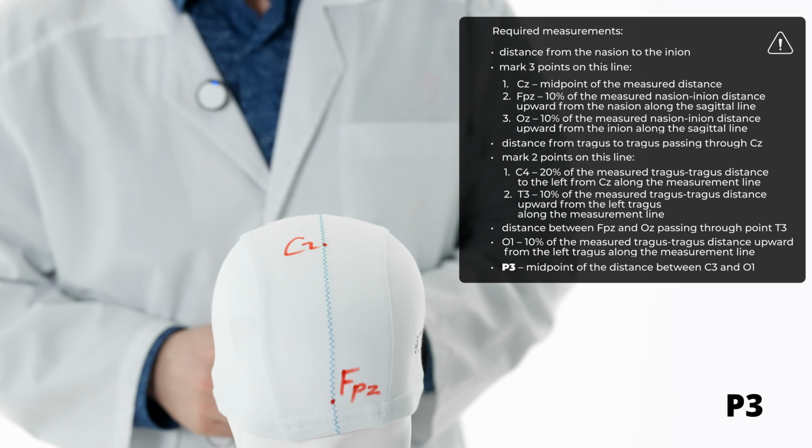Next point along this line is T3 point that lies 10% up from the left tragus. So in our case, this distance equals 3.4 centimeters, and mark T3 point. After that, measure the distance between the OZ and FPZ through T3 point. And this distance is 28 centimeters.